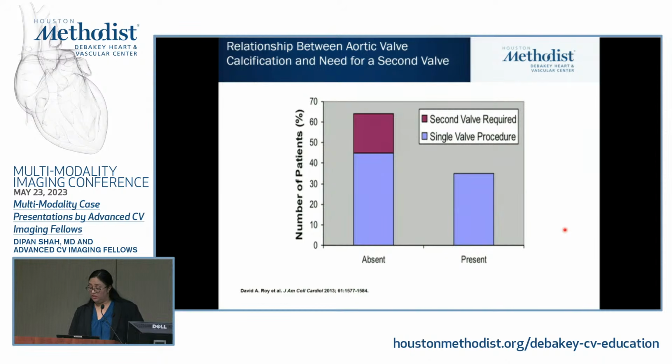Although this is encouraging with this study, the early generational valves had a lot of complications and also PVR. But with the newer generational valves, which have easy retrievability, repositioning capacity, an external sealing cuff that helps with the PVL, and unique anchoring mechanisms, this can potentially overcome the challenges that were seen with the early generational TAVR.